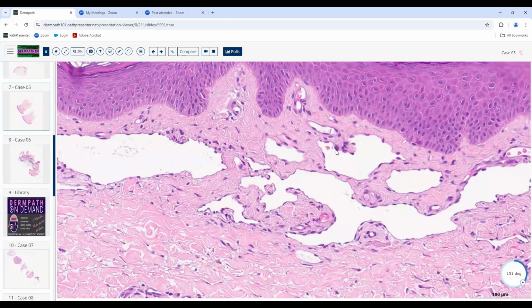Now, hobnails are nails that carpenters use and things like that. They're not like nails that have a flat top, like the ones used when you're hammering wood into a house, or those shot from nail guns now. When they have a little dome-shaped head to them, that's a hobnail, like here. So when they protrude into the lumen like that, and it's a hemangioma, then it's just known as a hobnail hemangioma.